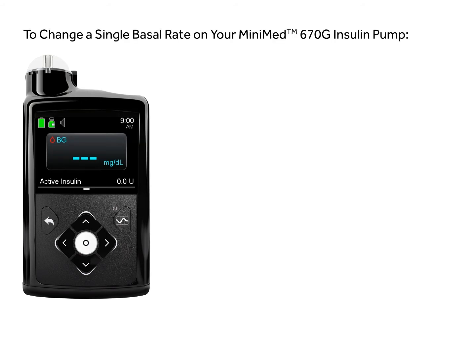This video will show you how to change a single basal rate on your MiniMed 670G insulin pump.